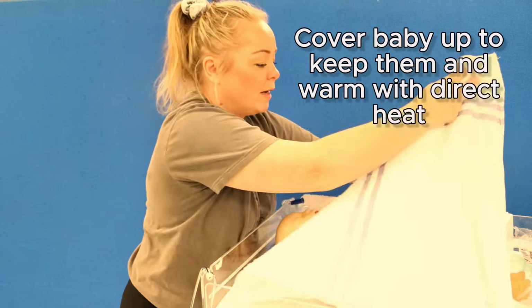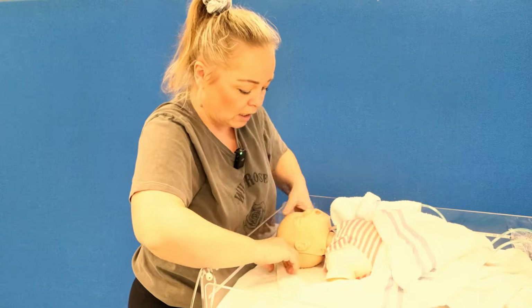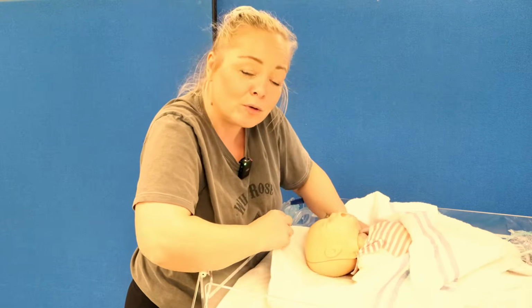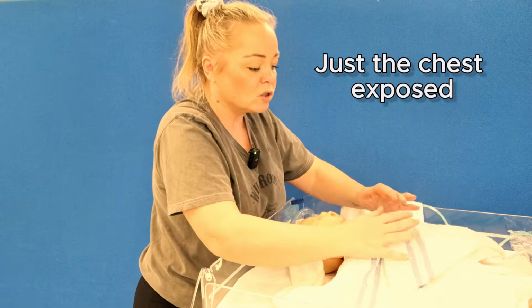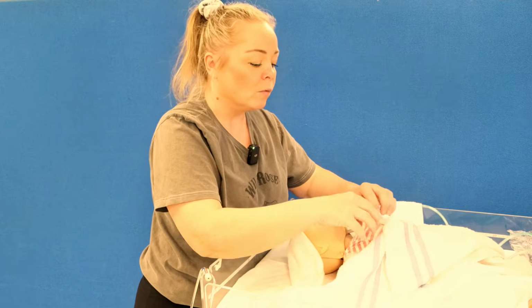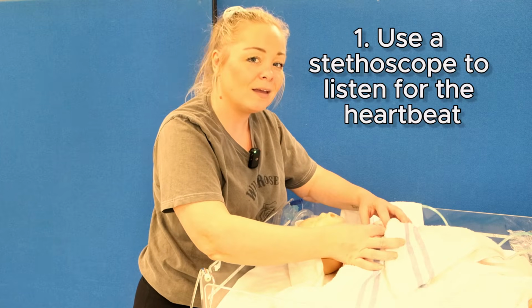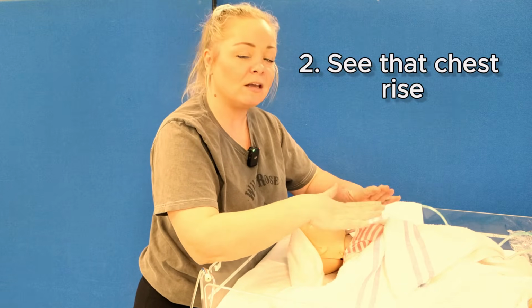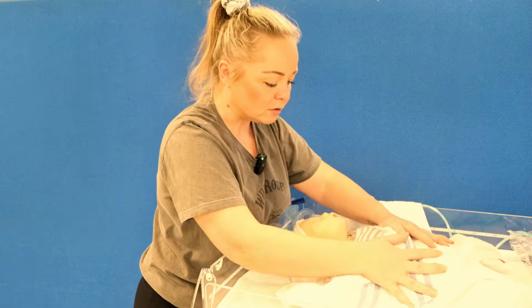And then we're going to cover baby up to keep them nice and warm with that direct heat as well. If you've got a little bonnet or a little hat, you can put that on baby. Otherwise, just wrap their head with the towel, keeping just the chest exposed. We want to keep the chest exposed because we need to, one, use the stethoscope to listen for the heartbeat, and two, we want to be able to see if we can see that chest rise, which we might not be able to see as well if baby is covered.